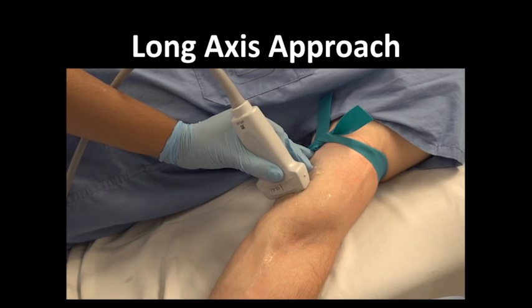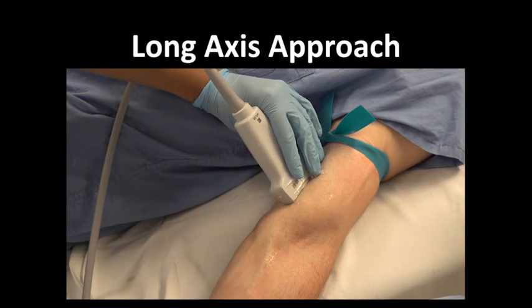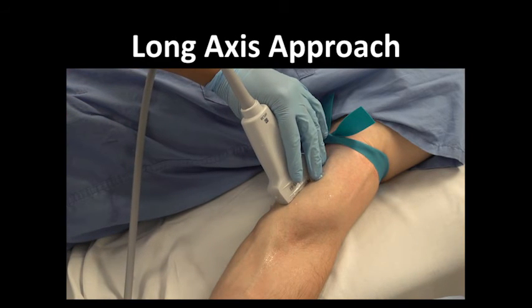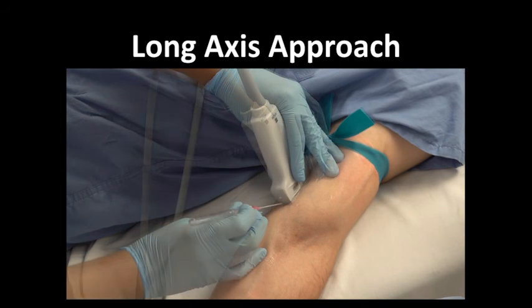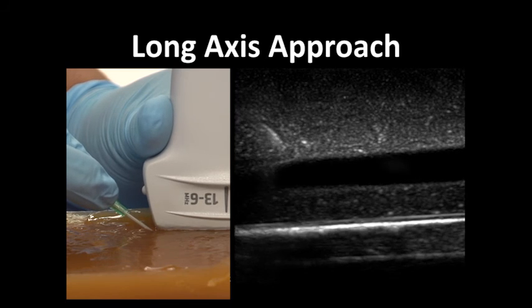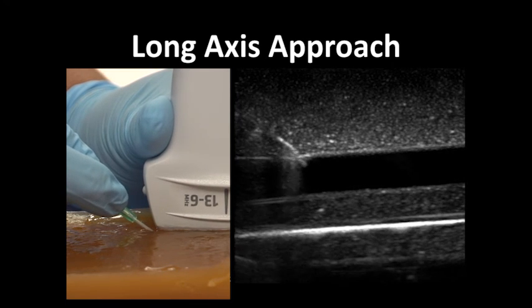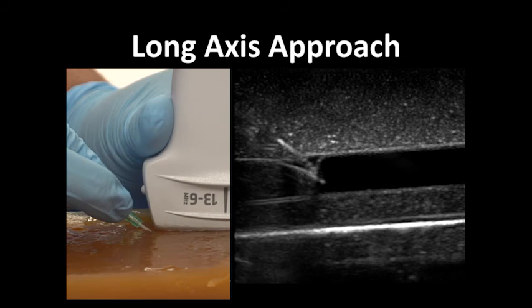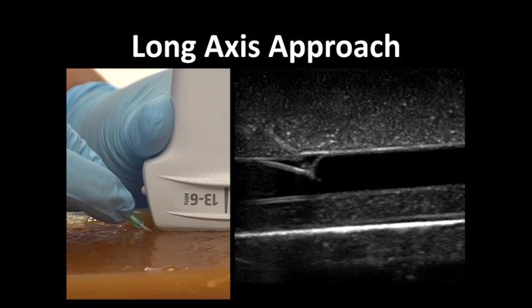To use the long axis approach, find the vessel in short axis and twist the probe 90 degrees. Once you are able to see the vessel in a long axis view, approach the center of the probe surface with the needle at 45 degrees. When using the long axis approach, it will be possible to see your needle tip and needle shaft at all times and watch the approach to the vessel of interest. Gently fan your probe side to side if you lose visualization of your needle tip, needle shaft, or the vessel at any time. Do not advance the needle if you do not see the entire needle tip and the vessel in the same picture.